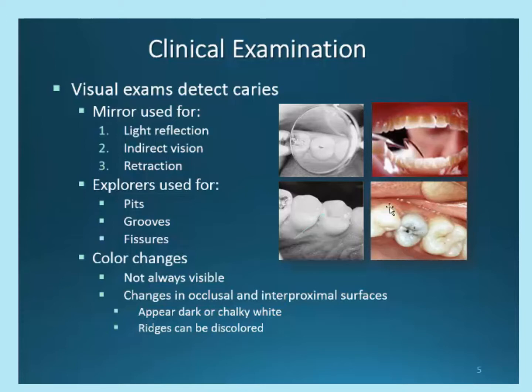I've got my cursor laying over one of these areas, and notice the change in the whiteness of this tooth that has got quite a bit of decay in it. Again, this arrow is also illustrating this whitened area, and then of course the darkening on the interproximal surface.